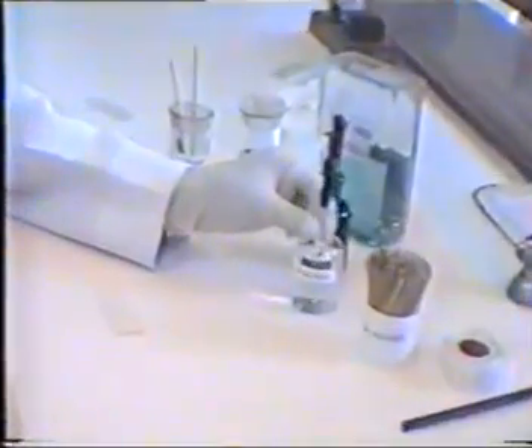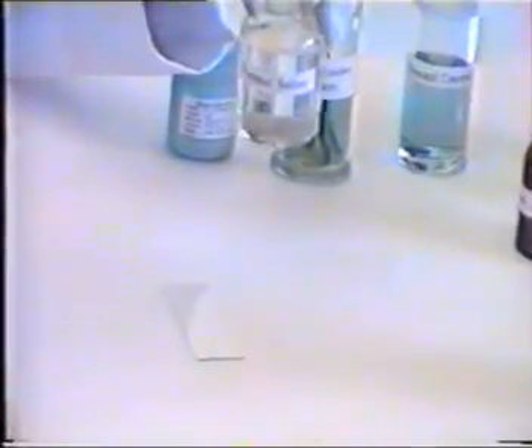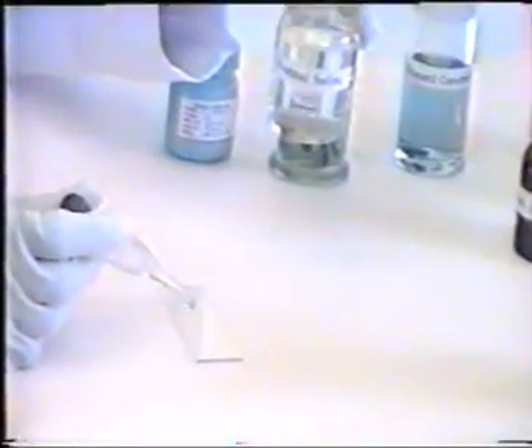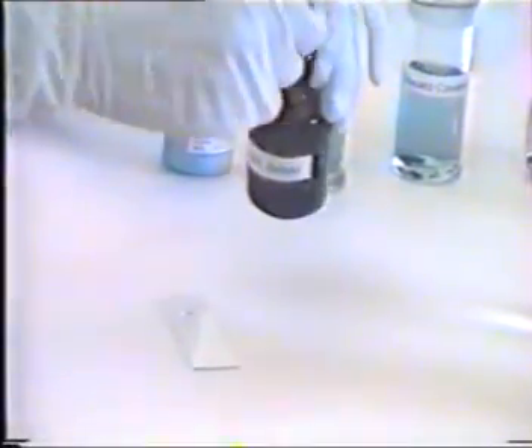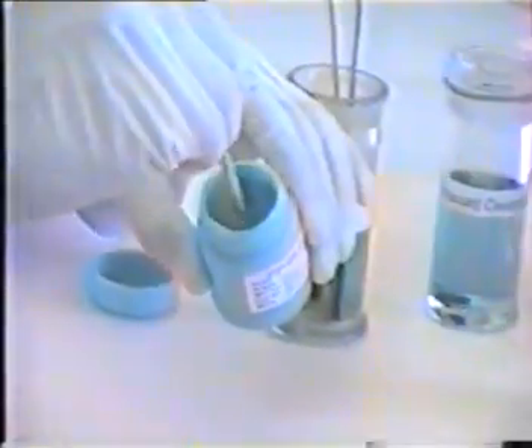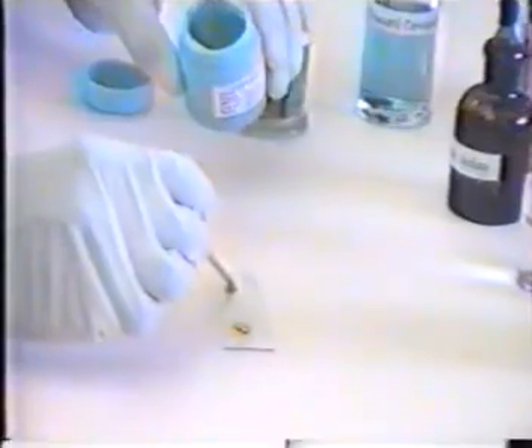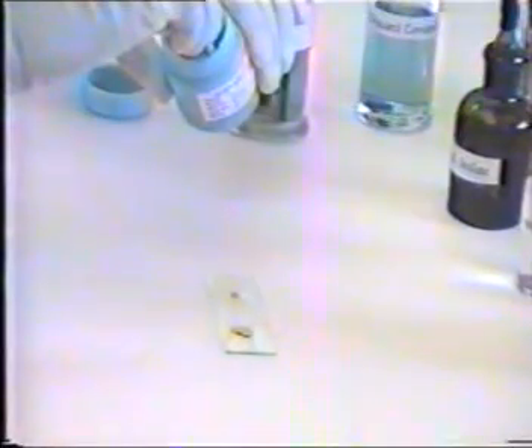Take the slide and place one drop of saline in the middle of the left half and one drop of iodine in the middle of the right half. Do not place them too close to the edges. Using an applicator stick, take a small portion of the faeces. If it contains mucus or blood, take from such areas.